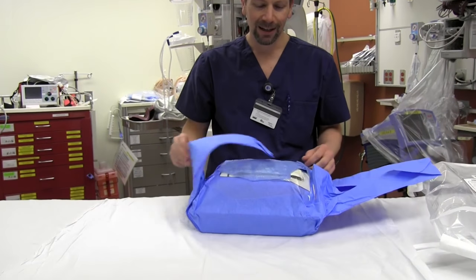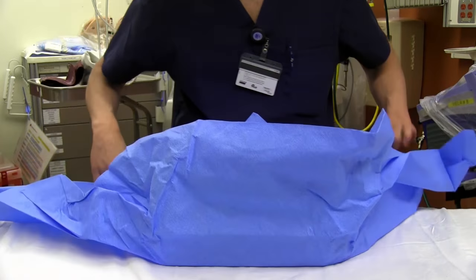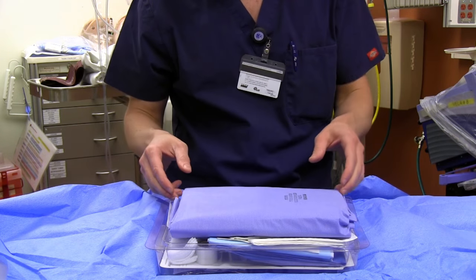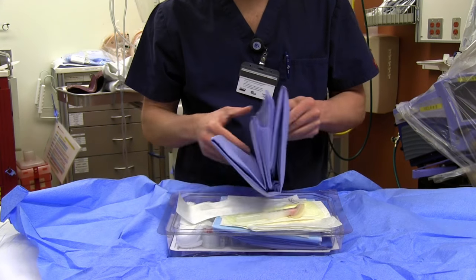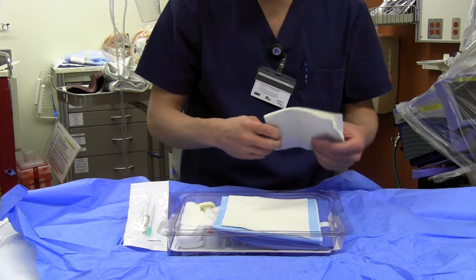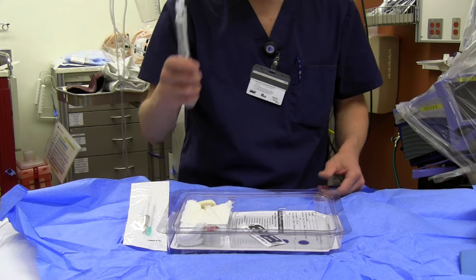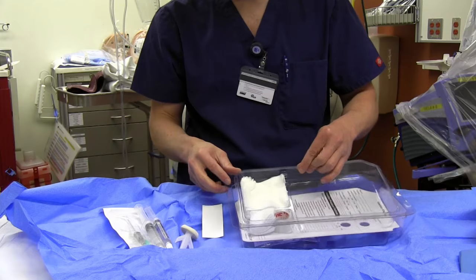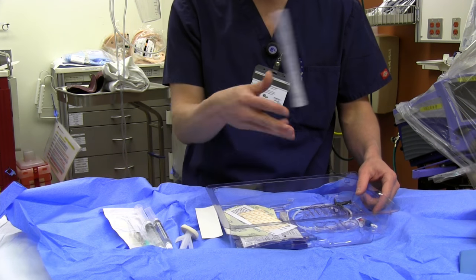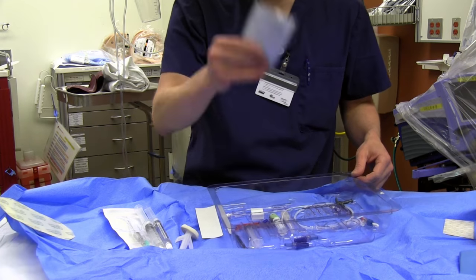This is the kit. You can get your mask, hat, and everything on. You can check out the patient's vessel with the tourniquet. Obviously you're full sterile, you've consented the patient, you've done your time out. Your gown, additional gloves — I always grab gloves from the carts because I like the gloves I like. You have your drape — this is the non-fenestrated drape. Chlorhexidine. These are your needles — hold on to those, you're going to need them. This is to wipe your hands if they're wet. Fenestrated drape, additional drape for the arm, ultrasound probe cover, two saline flushes, additional chlorhexidine, some 4x4s, some tape, central line or midline checklist, additional measuring tape in case you haven't measured already, Steri-Strips for securement, warning instructions, Tegaderm, Statlock to secure.